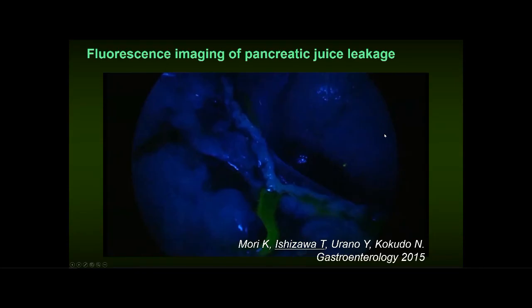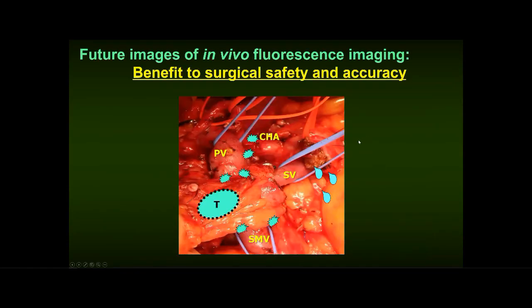So I believe that in the near future, intraoperative fluorescence imaging will develop into an essential intraoperative navigation tool, enabling us to understand the accurate area of the cancer spread with some kind of functional information of the organs, which may enhance the surgical outcomes.